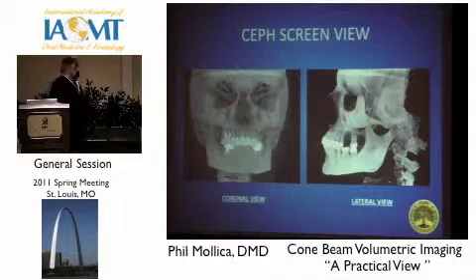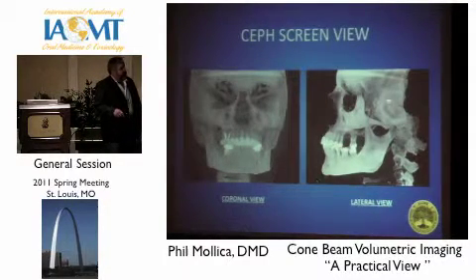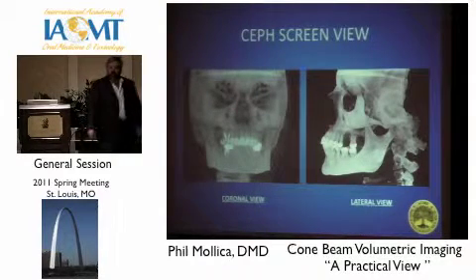Ceph views. Ortho world, man. We can take a look. Lateral skull views, we can do coronal views, all in one shot.